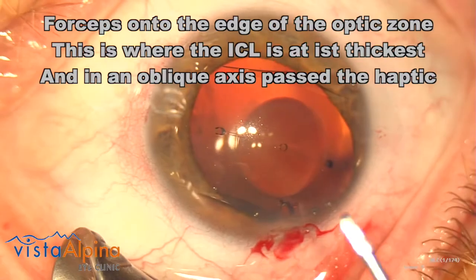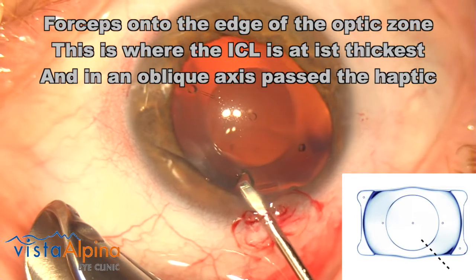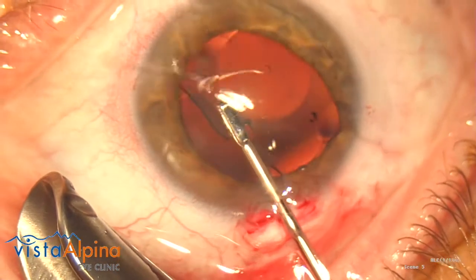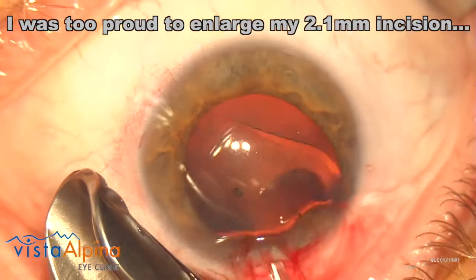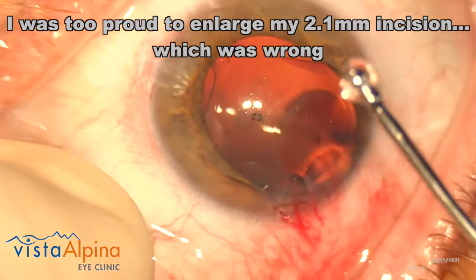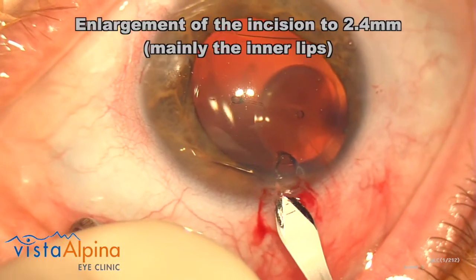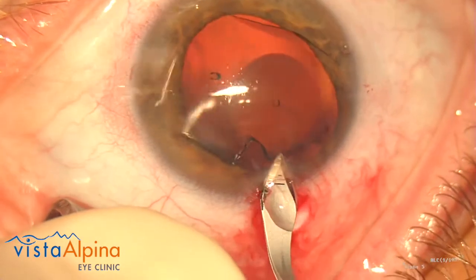The best place to grab the ICL is the edge of the optic zone because of its thickness. We prefer an oblique axis as this will allow us to extract the ICL with the smallest possible corneal incision. But in this case I exaggerated a bit in terms of small incision removal and I had a couple of unsuccessful bites into the ICL. In the end, I had to enlarge my 2.1 incision to 2.4, mainly on the inner lips of the incision.